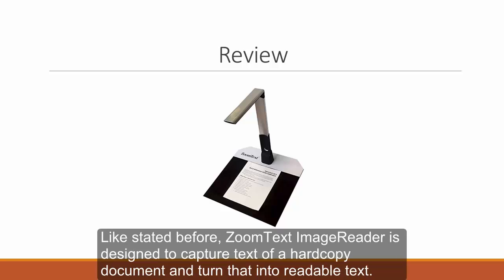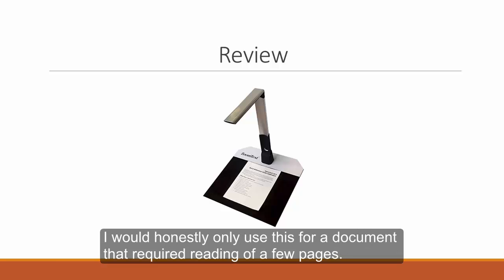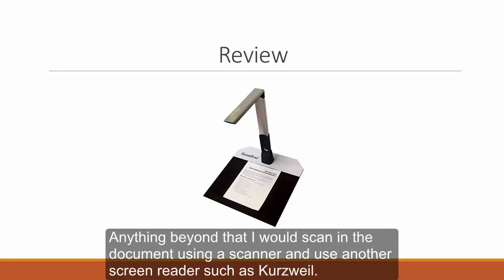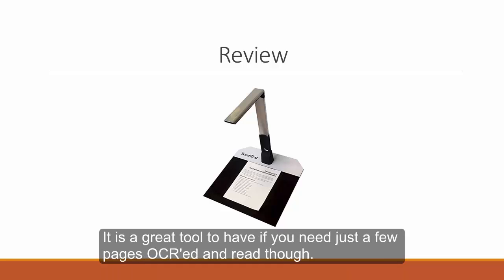Like stated before, Zoom Text Image Reader is designed to capture text of a hard copy document and turn that into readable text. I would say that it does just that. I would honestly only use this for a document that required reading of a few pages. Anything beyond that, I would scan in the document using a scanner and use another screen reader such as Kurzweil. I do not think that the screen reading part of the software was as accurate as other screen readers or Kurzweil. It is a great tool to have if you need just a few pages OCR'd and read though.